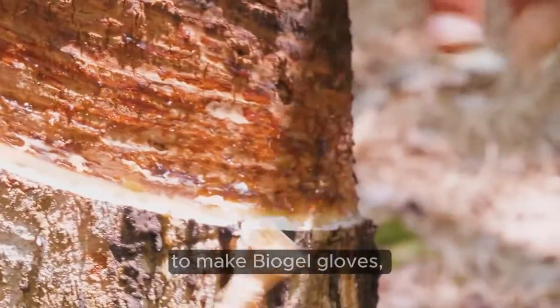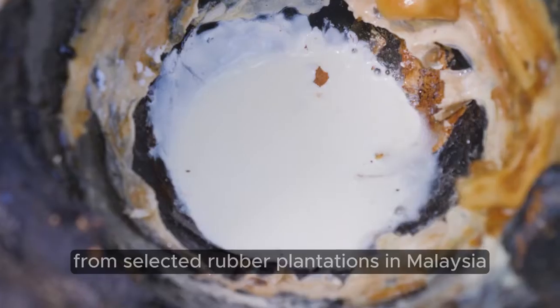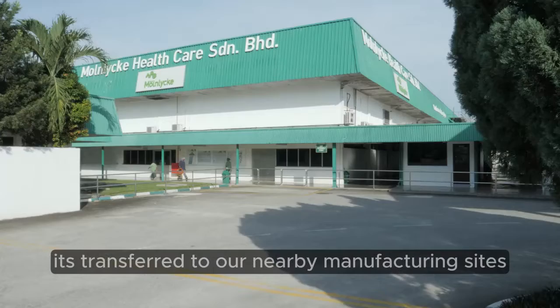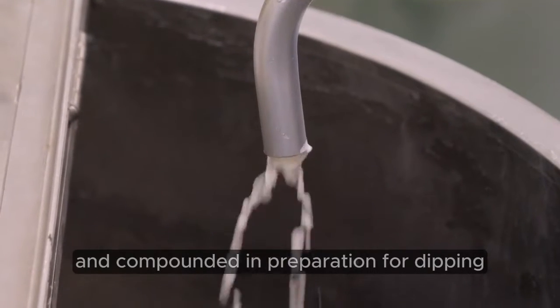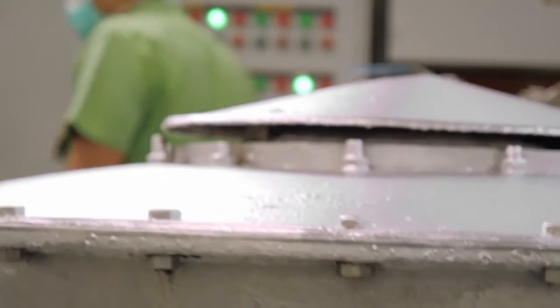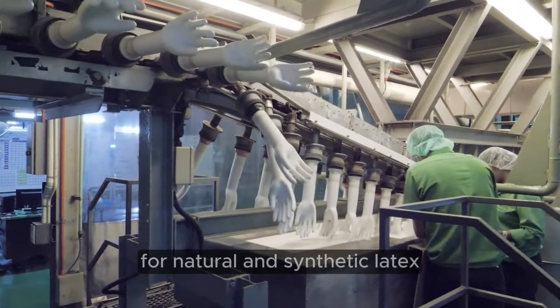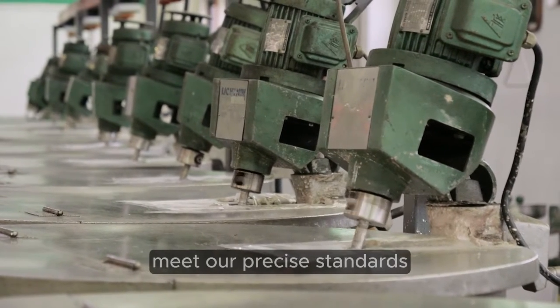To make Biogel gloves, raw natural rubber latex is sourced and harvested from selected rubber plantations in Malaysia. After the natural rubber latex has been processed, it's transferred to our nearby manufacturing sites, where it's checked and compounded in preparation for dipping. While the sourcing of the raw material differs for natural and synthetic latex, we continually test the quality to ensure that both materials meet our precise standards.